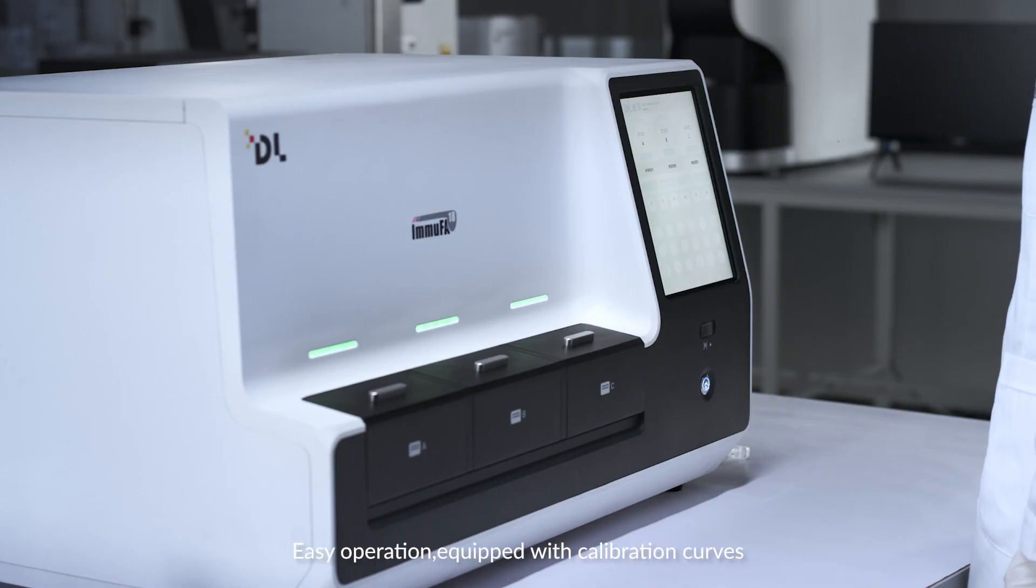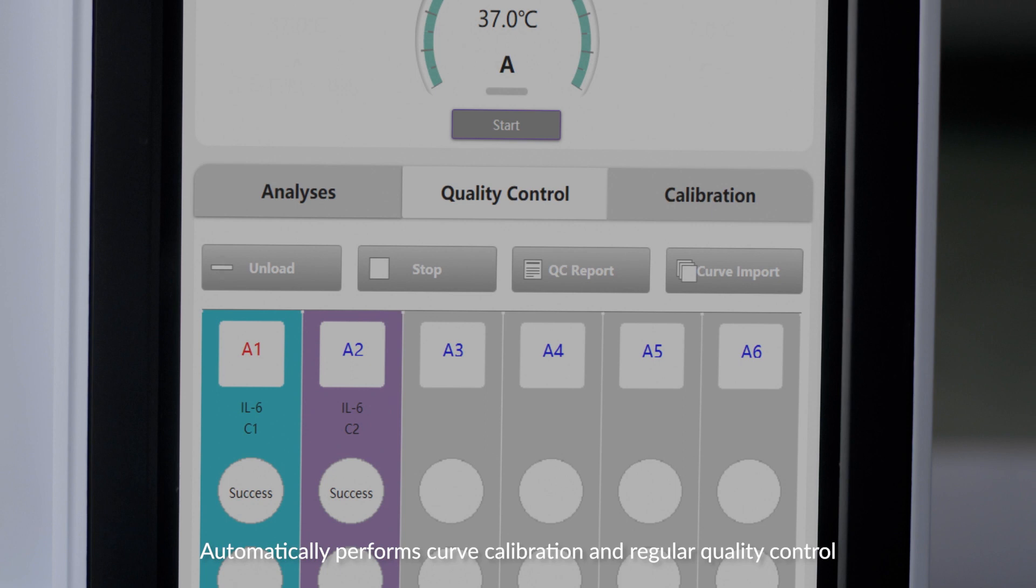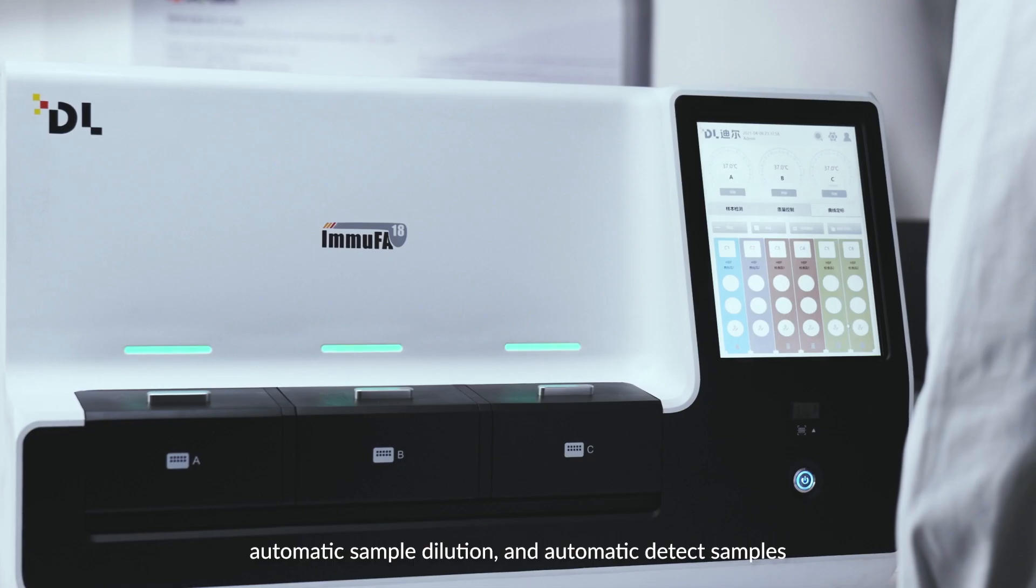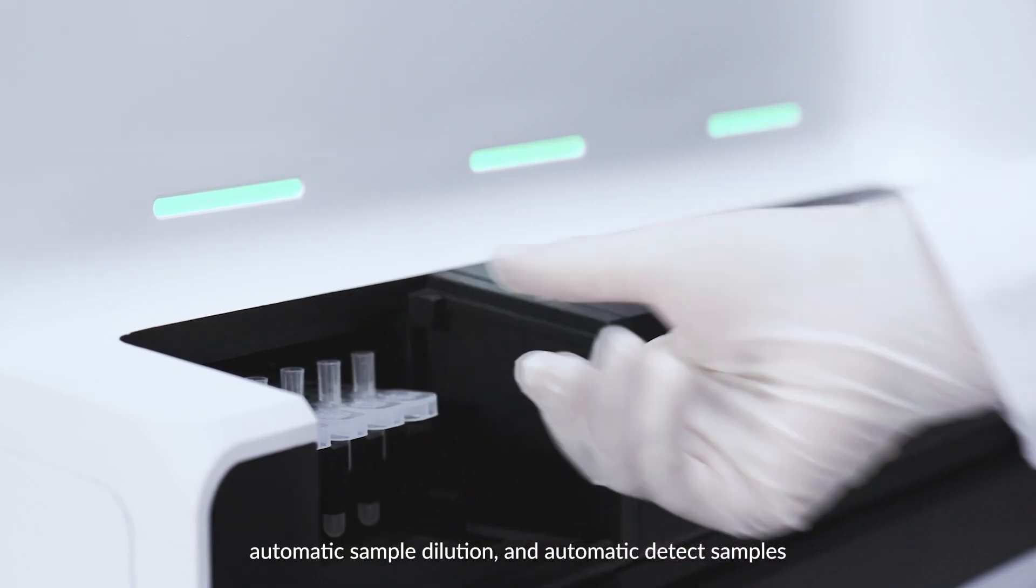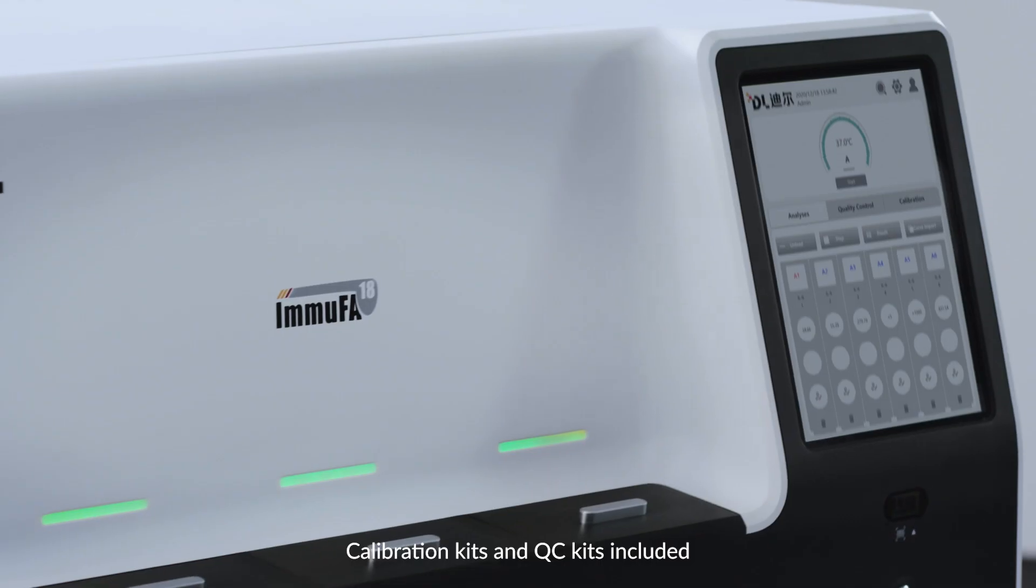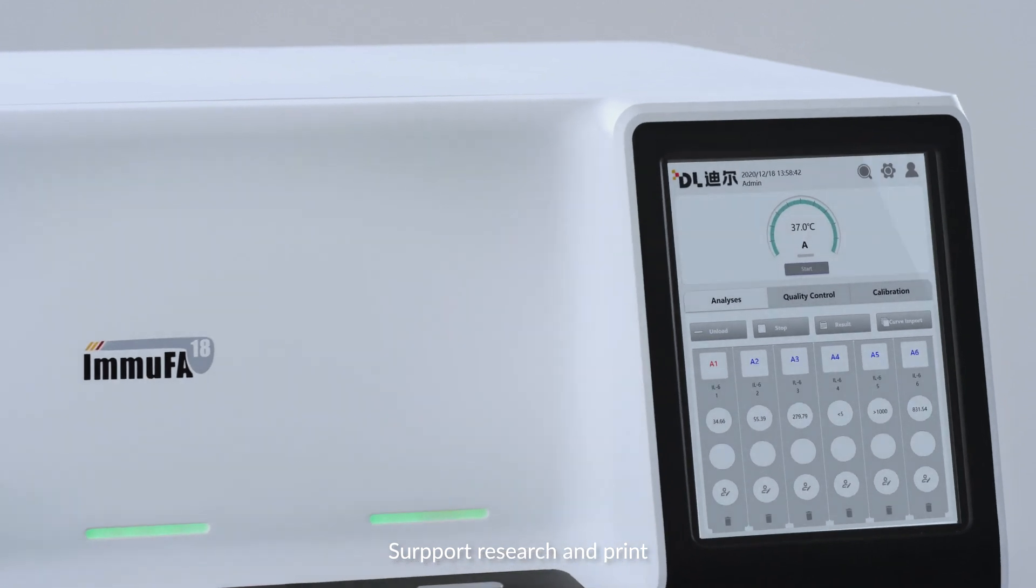The instrument is easy to operate. Equipped with calibration curves, it can automatically perform curve calibration and regular quality control, and also automatically do sample dilution and detect samples. The calibration kits and QC kits are included in the reagent package. It also supports result researching and printing.